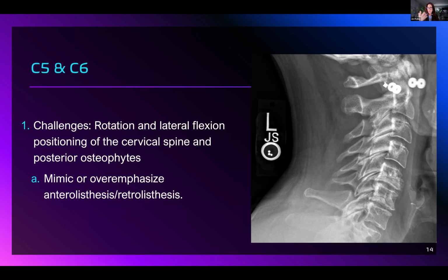To show, particularly when we flex and extend, because that's what we are. We are weight-bearing creatures, and so we want to stress the spine in an upright position as well. And the left is because they put a left here. A lot of times I don't see them on the lateral images, which to me is not a big deal, but they're using left because the left side is against the panel or the bucky. But we do need to see those on the AP views, particularly for medical legal cases.